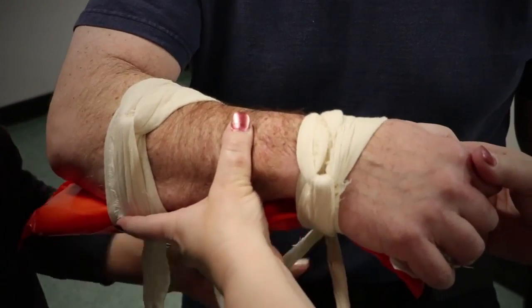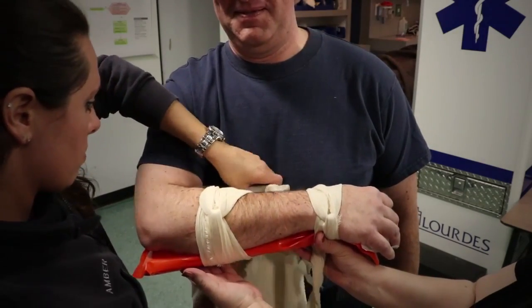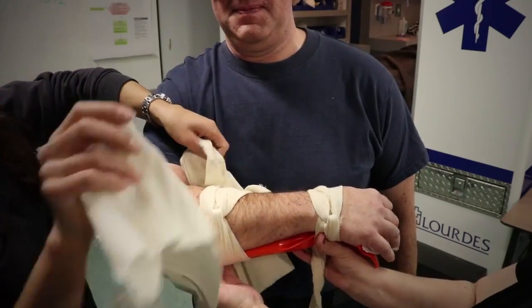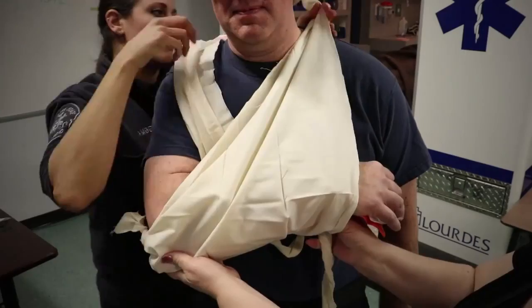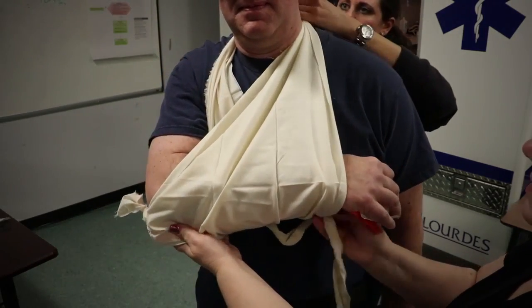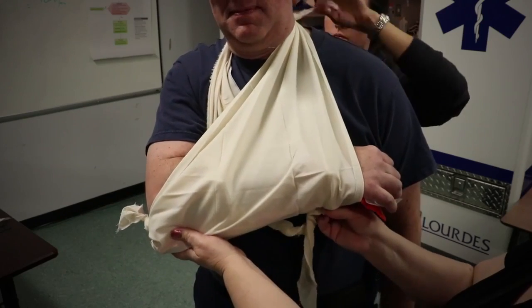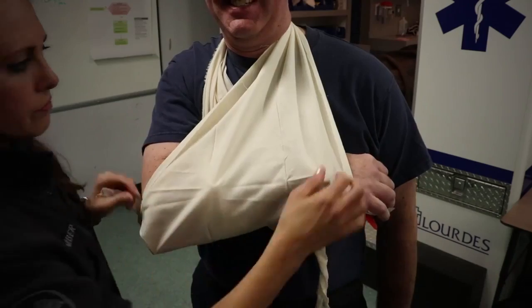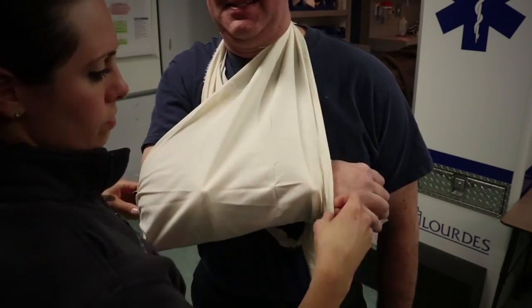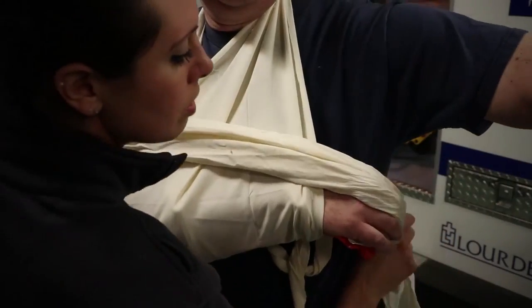Secures the entire injured extremity. Immobilizes the hand in the position of function.